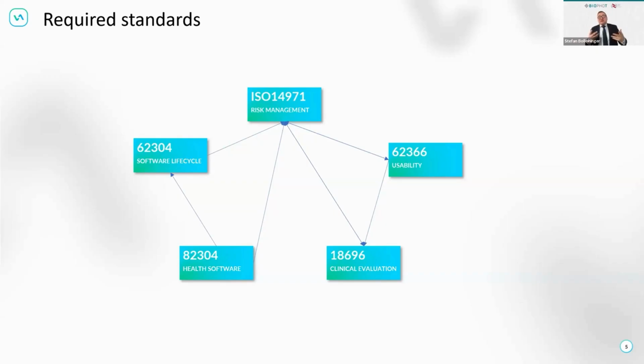But the curiosity insight, what does it do? Does it calculate something? Does it give additional values to a patient, to the doctor, where it can be relevant? Does it create scores about the patient's behavior or the patient's body physique, fitness, clinical status? If that's the case, then this is part of the decision support systems. Then it will be a medical device.